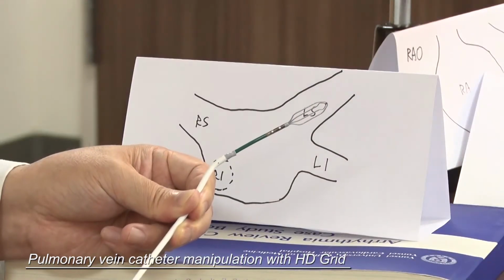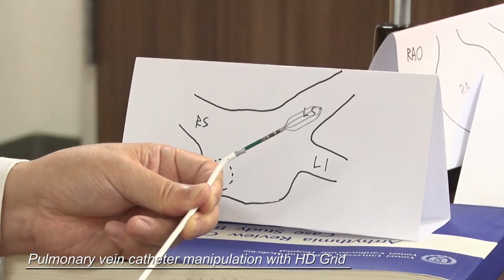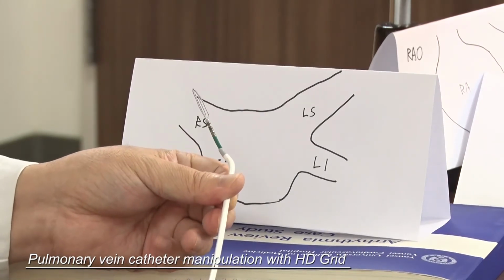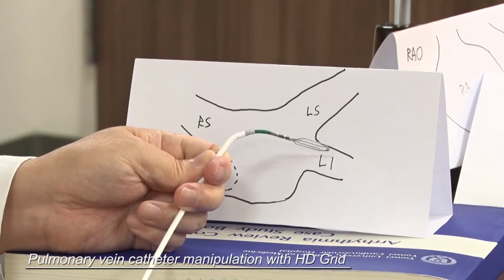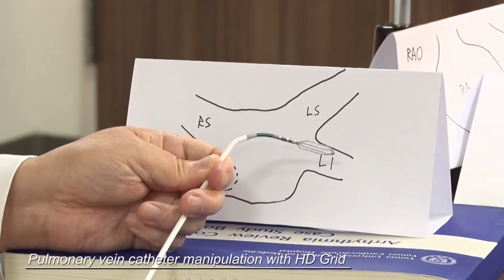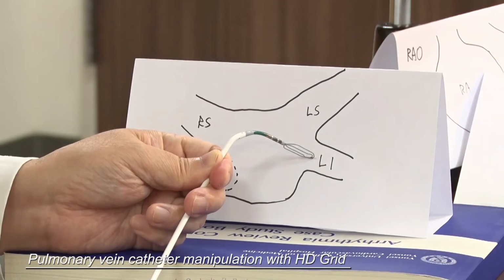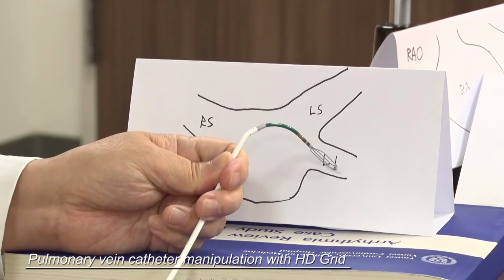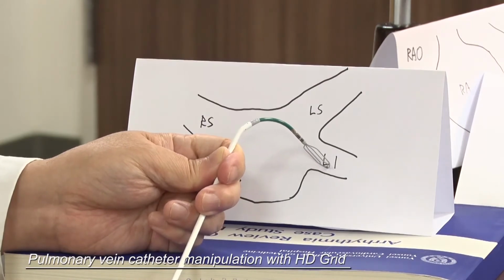And if you move to the right upper pulmonary vein, just apply clockwise torque to the whole system, and your catheter will move to the right side pulmonary vein. If you curve down, apply clockwise torque, make a posterior inferior drag, and just push the catheter. If you are lucky, you can put your catheter inside the left inferior pulmonary vein.